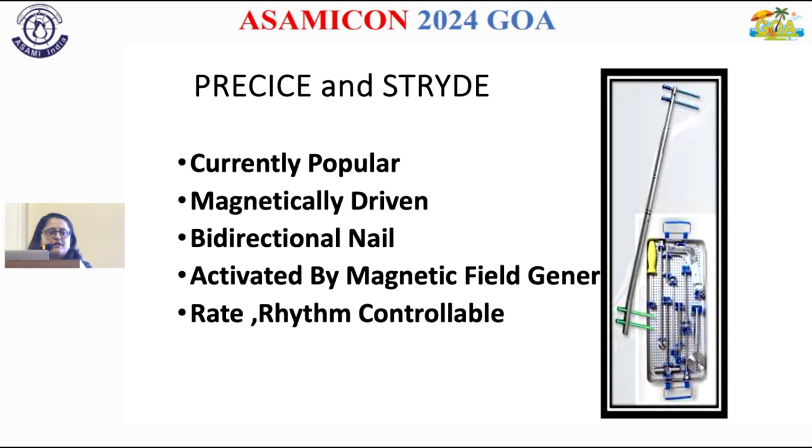So coming to the last player, and that is self-lengthening nail. PRECICE is the most popular nail right now. It is a magnetically driven bidirectional nail activated by a magnetic field generator. And you can control rate and rhythm of the lengthening.